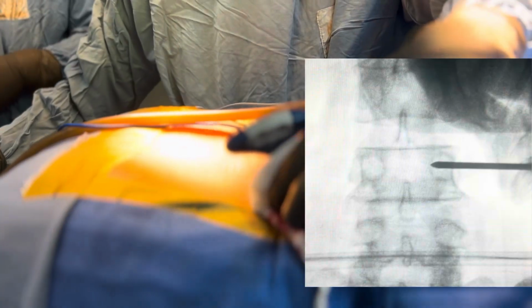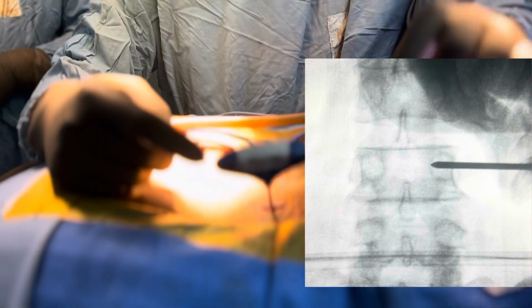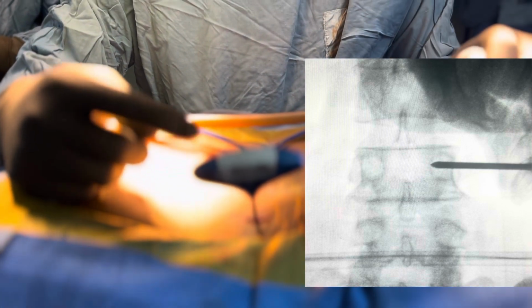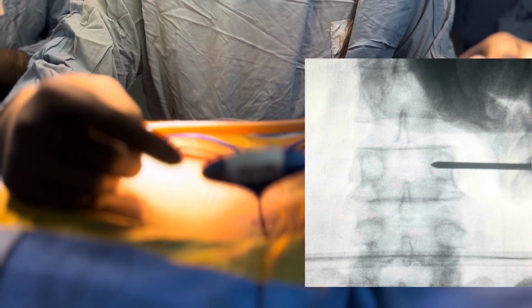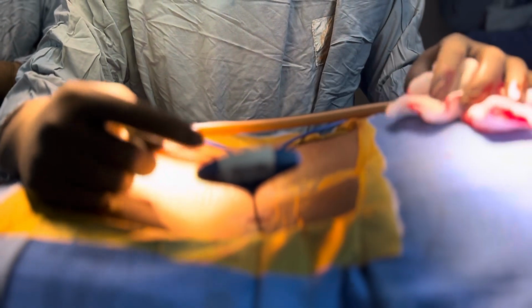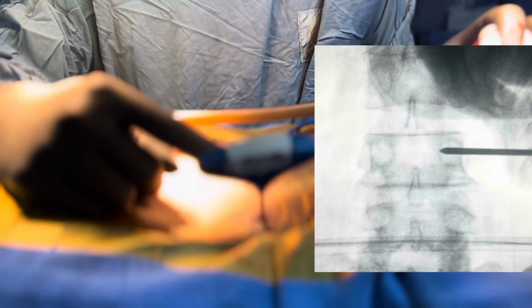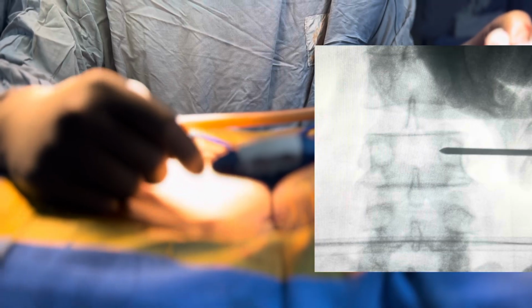Go till the medial border of the pedicle and then take a lateral. Don't cross the medial border of the pedicle in AP view so that you can avoid breaking the pedicle. So we need to confirm in lateral that we are entering the body and we are still not in the pedicle. I have reached the medial border of the pedicle in AP view.